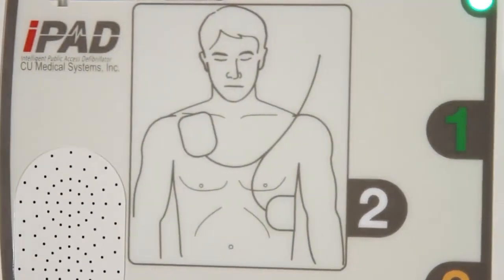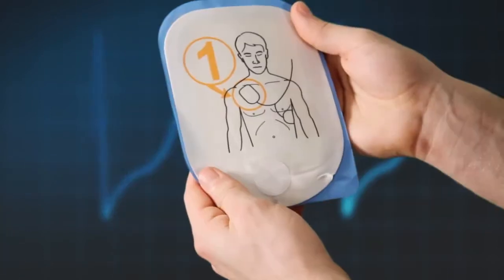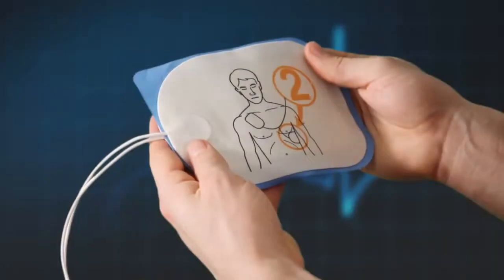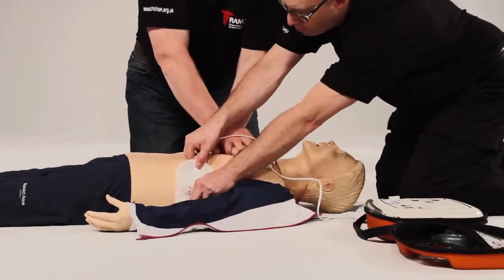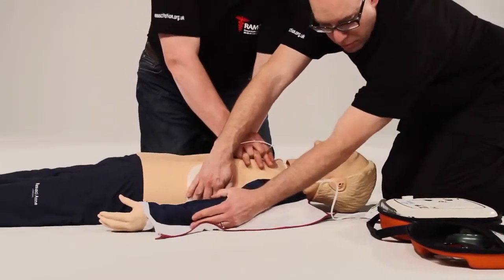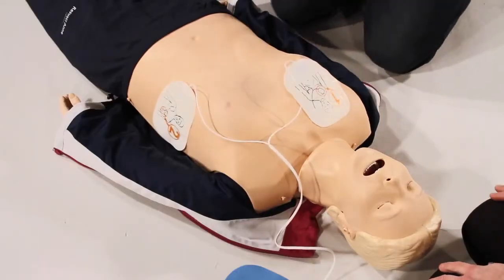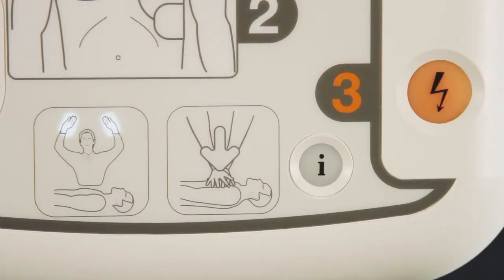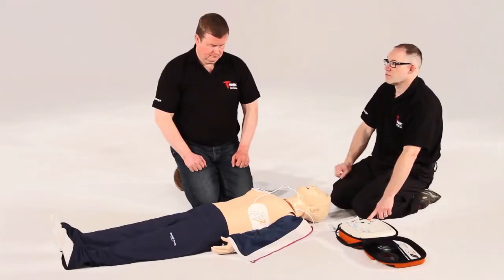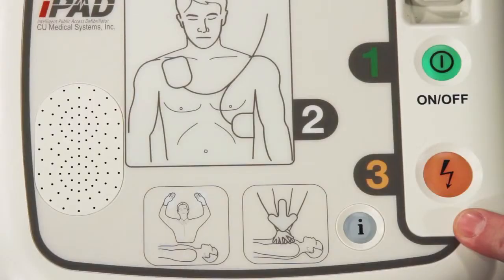The AED will prompt you to remove the pads and place them as shown on the pictures. Should you place the pads at a pace faster than the voice prompts, the iPad SP1 AED will catch up with you. The iPad SP1 AED will then prompt you to ensure that no one is touching the patient — stand clear. If a shock is advised, the iPad SP1 AED will charge to a predetermined level and advise you to once again check everyone is standing clear, and then to press the flashing orange shock button.